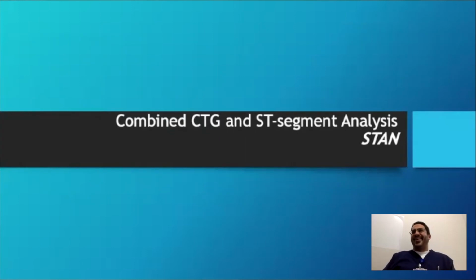Basically, it's looking at the CTG as a whole and the ECG signal, and it's comparing the ECG signal for that baby to itself, looking for changes of the ST part of the ECG signal. Because that's the part when the baby, supposedly at rest, is recovering from the cardiac contraction.